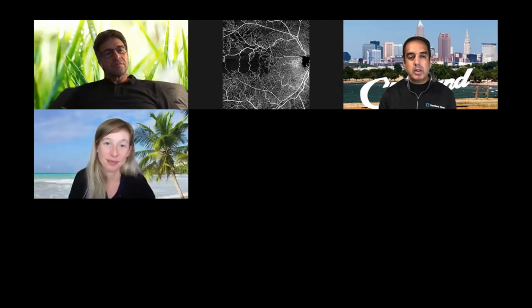Yeah, I think Sarah's case has illustrated what we all do in clinical practice, where it's really multimodal imaging together, taking all of those images together to understand best what to do with that patient. I particularly have found differences in the cameras regarding fundus autofluorescence. I don't know if you've perceived that at all.